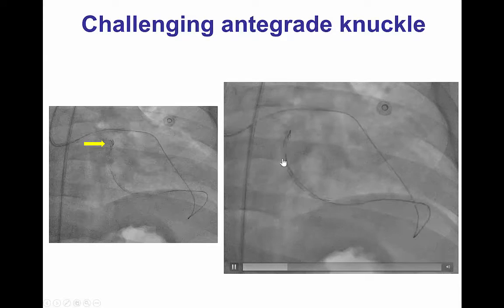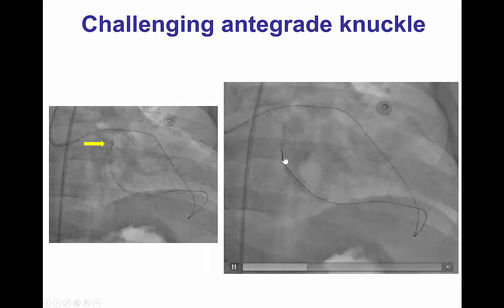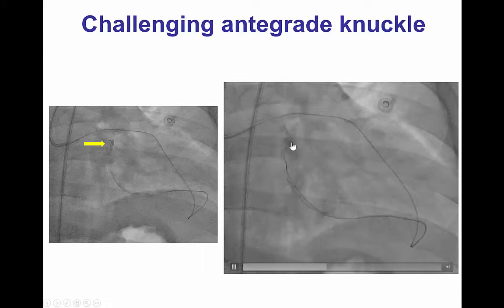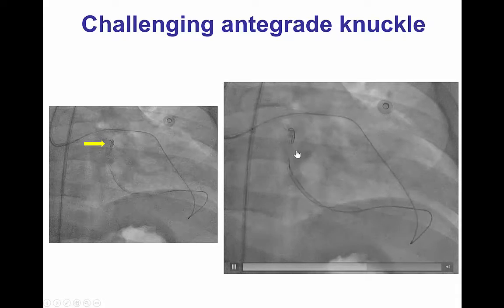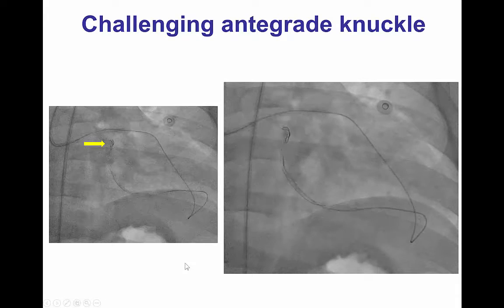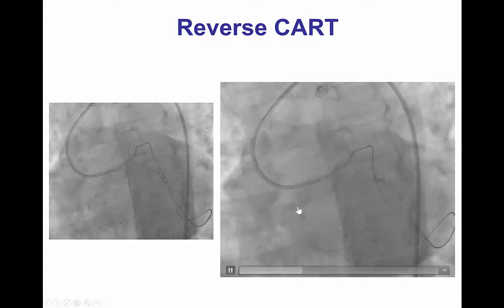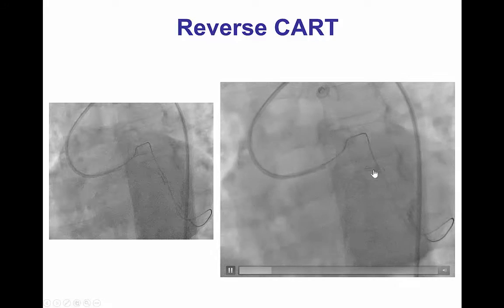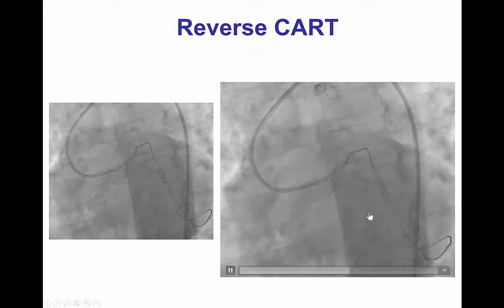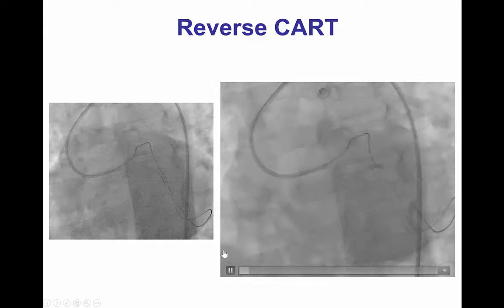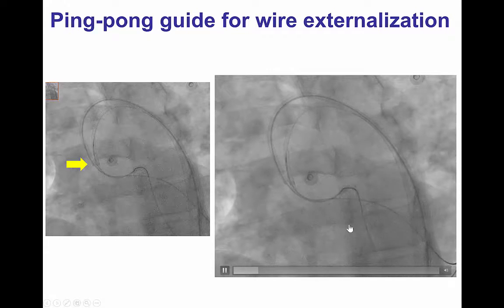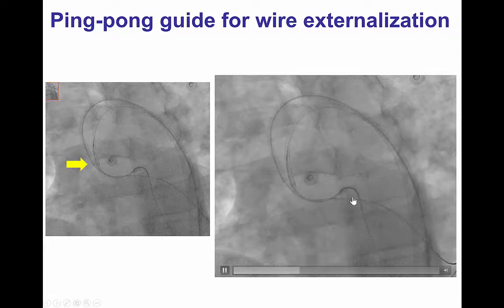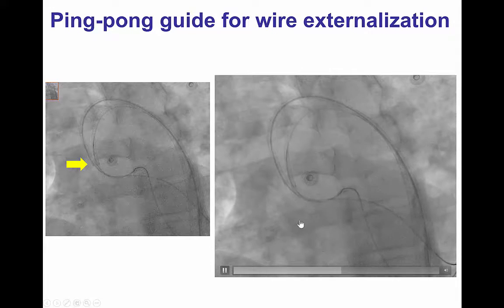It was challenging advancing the retrograde wire due to severe tortuosity and calcification in the circumflex. However, we were able to perform the reverse CART in the mid-circumflex and then we were able to snare and externalize the retrograde guidewire.